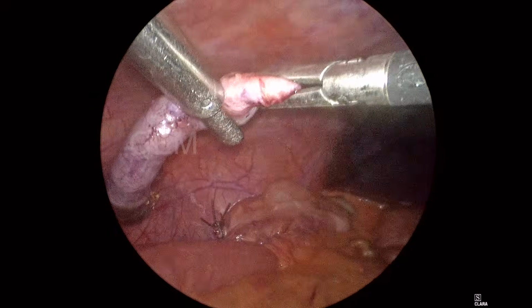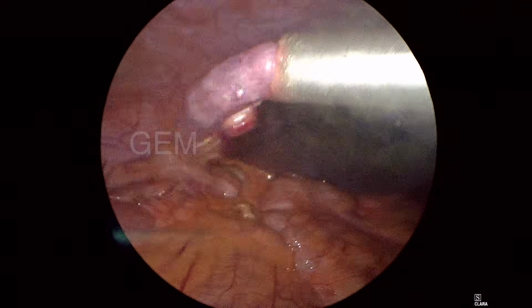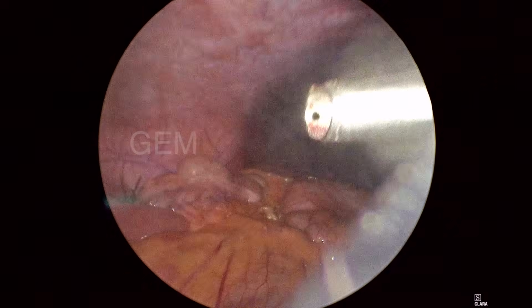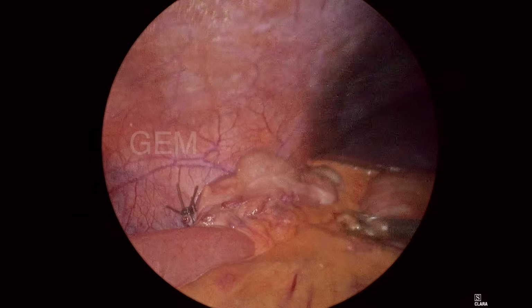So I'm taking out the appendix through the 7 mm port. The fat also I'm taking out.